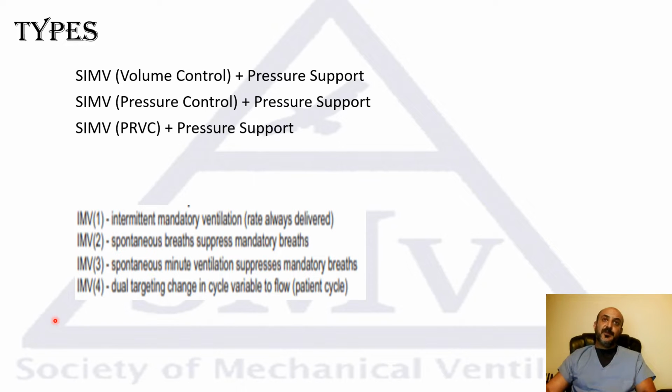So the mode evolved over the years. In the beginning, there was no pressure support for the spontaneous breaths. Now it's mostly used with pressure support to support the additional spontaneous breaths. Now it could be used in the volume controlled mode with pressure support, in the pressure controlled mode with pressure support, and in the adaptive modes like PRVC with pressure support. And it's very important to know the ventilator that you are using, because some ventilators have many different SIMV and SIMV plus modes that might act differently from our regular understanding.